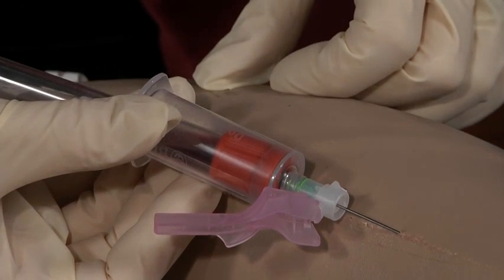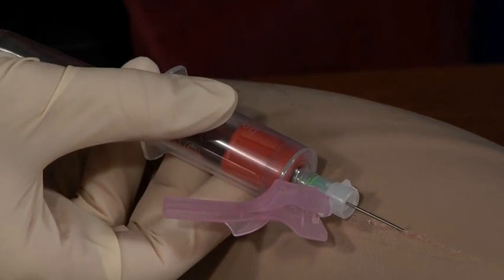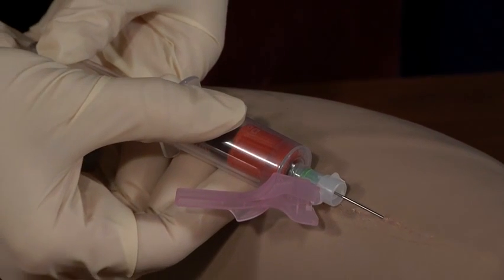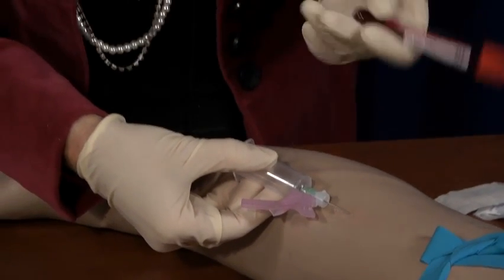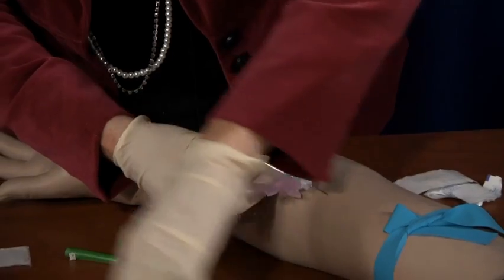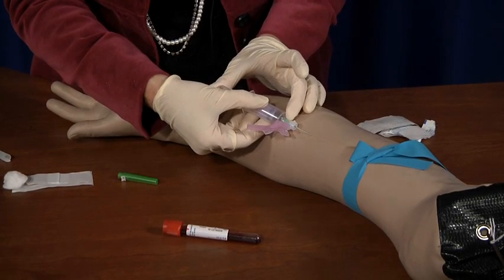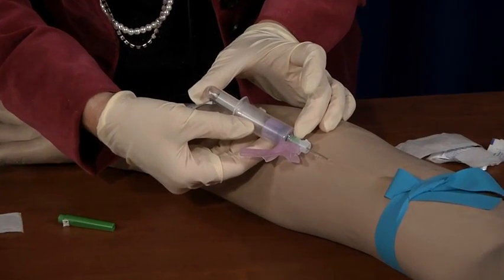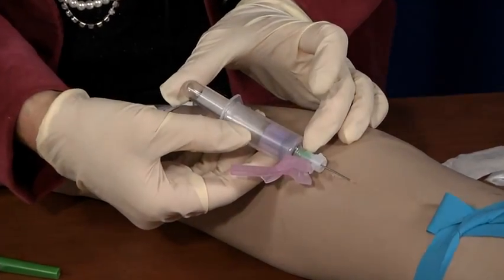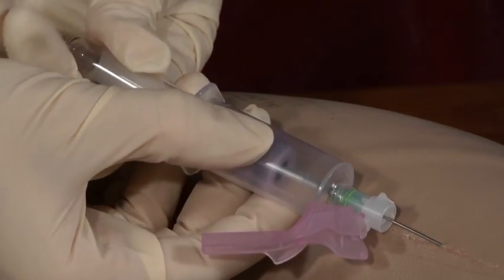Once it's full, and we won't allow this to get totally full, it'll be a while, and you need a different kind of tube for a different lab value, we are going to hold very tight the needle in place. Put that one to the side and pick up your other one very carefully. And we're going to push this one down onto the needle. And again, it's filling up with blood. Once you've gotten all the blood that you need, take your tubes, set them to the side.